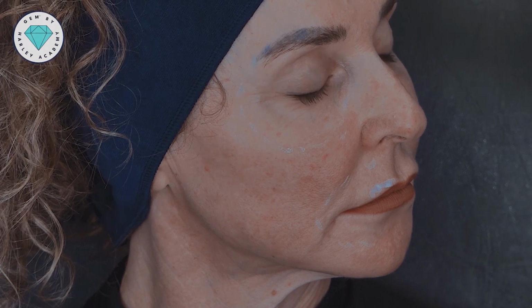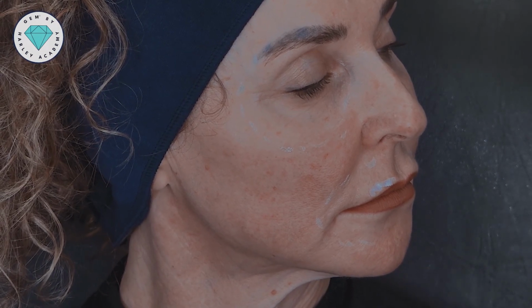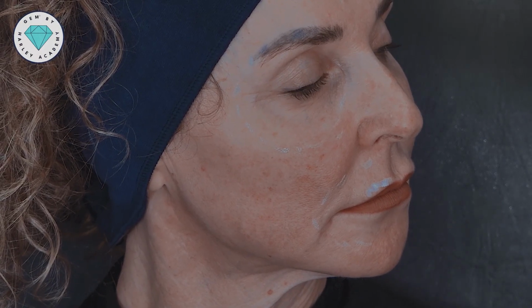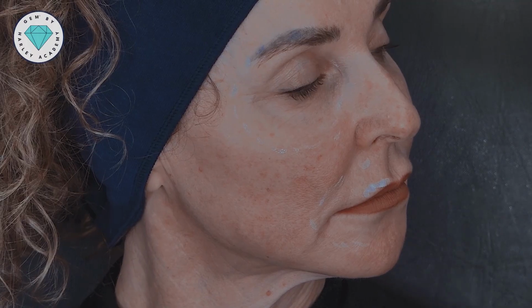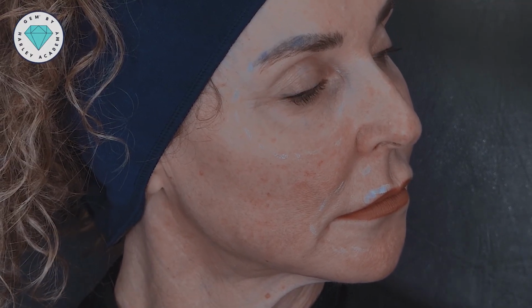And for me, this is very subtle, okay? I don't think that many patients would even notice this, but what we can see as injectors is the consequence of repeated treatments, the consequence of incorrectly identifying the lip compartments or using the wrong products, and that will then ultimately lead to migration of product or displacement. So that's characteristic in the upper lip.